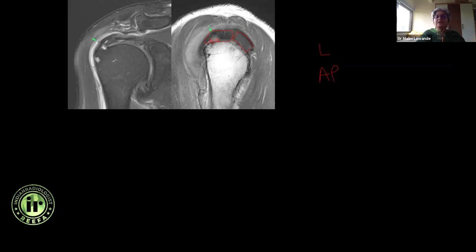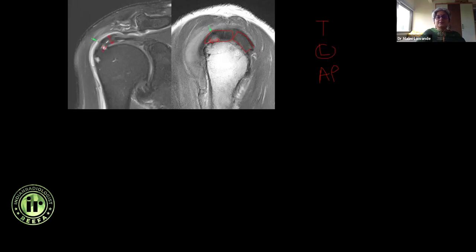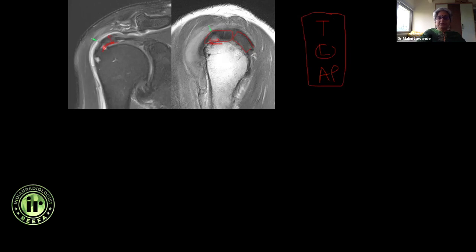Without significant retraction — it's barely retracted, maybe just 2 millimeters. So: no significant retraction, or retracted by 2 millimeters — that's the longitudinal extent. There are three things: thickness (how much of the thickness), longitudinal (how long is the tear), and AP (this dimension on the sagittal images). Every tear, you need to address all three of these.